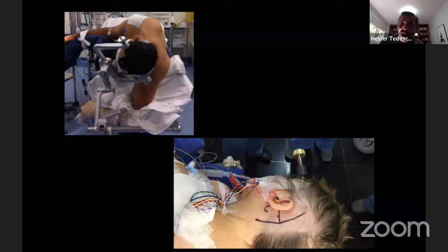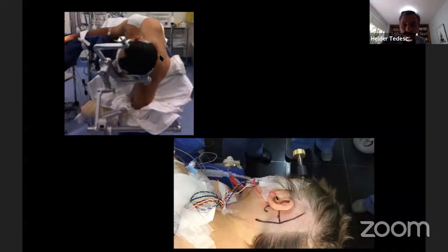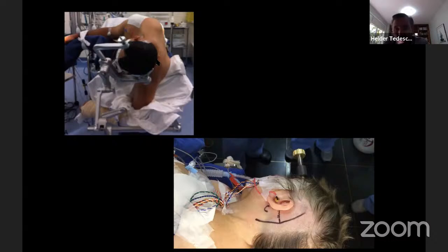Let's see if I can. You see? Head up, face down. Yeah, exactly. And tilt, the ear should be tilted towards the upper shoulder. Perfect. I use this position for acoustic and posterior fossa, in the petrosal approach also, to liberate the jugular and the contralateral sigmoid. It's very important. And it stays completely free this way. And the problem that he had, he explained that this shoulder went up and closed the vein here. This is the main trick, the surgical position.